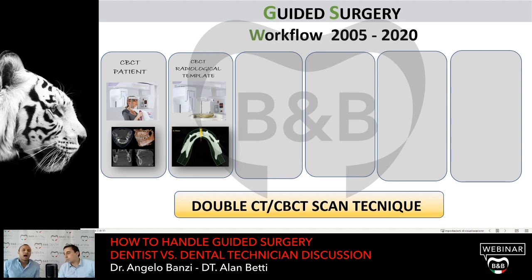I have the opportunity to get the two files immediately because in my clinic I've got the CT combine. So the first thing that I do when the patient comes to my clinic is checking the prosthesis in the mouth of the patient. Most of the time it has to be changed.